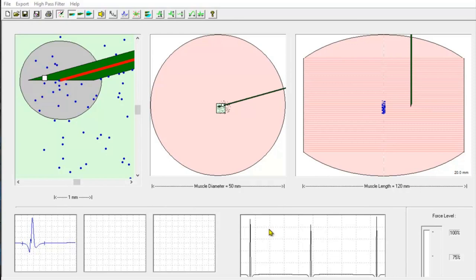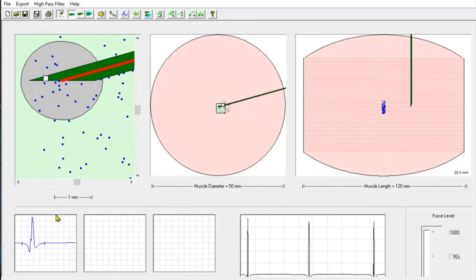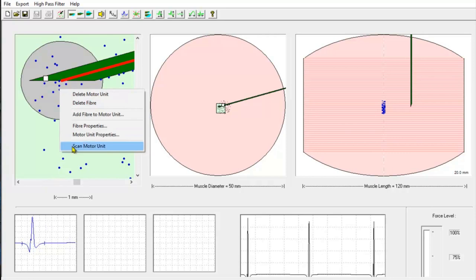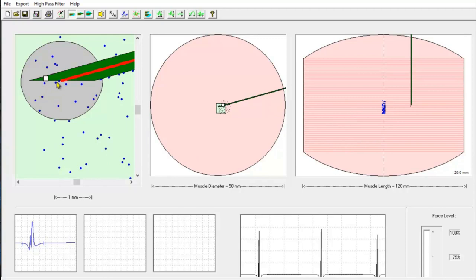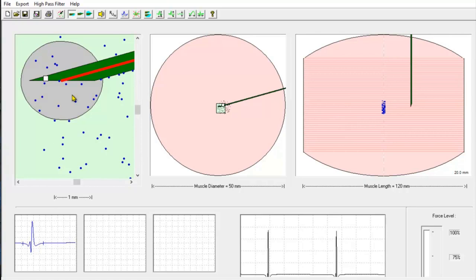Now we are going to look at myopathy. I have introduced fibers randomly and the electrode here, and we obtain this signal in the normal situation. Is polyphasicity in myopathy due to loss of muscle fibers? Here I delete one fiber after the other, and you can see the result. We remove one fiber, another fiber, more fibers. And you see that the signal really doesn't become polyphasic, but rather more simple and lower in amplitude and shorter.